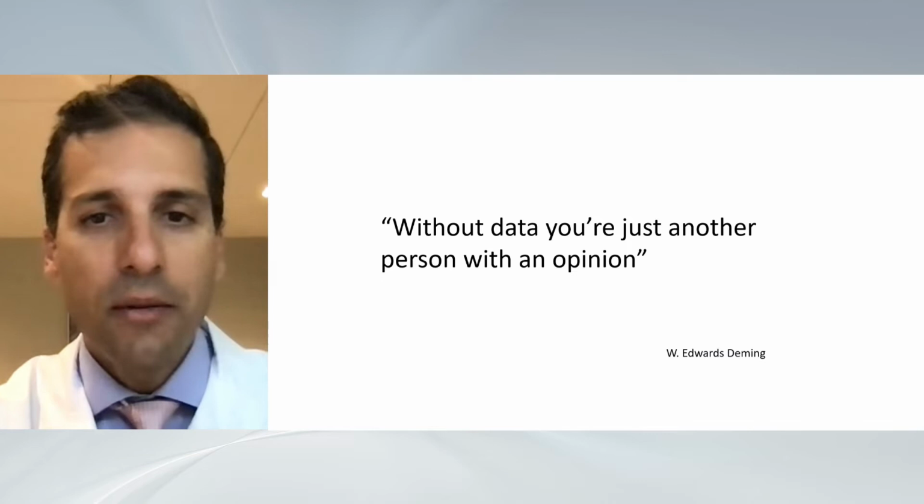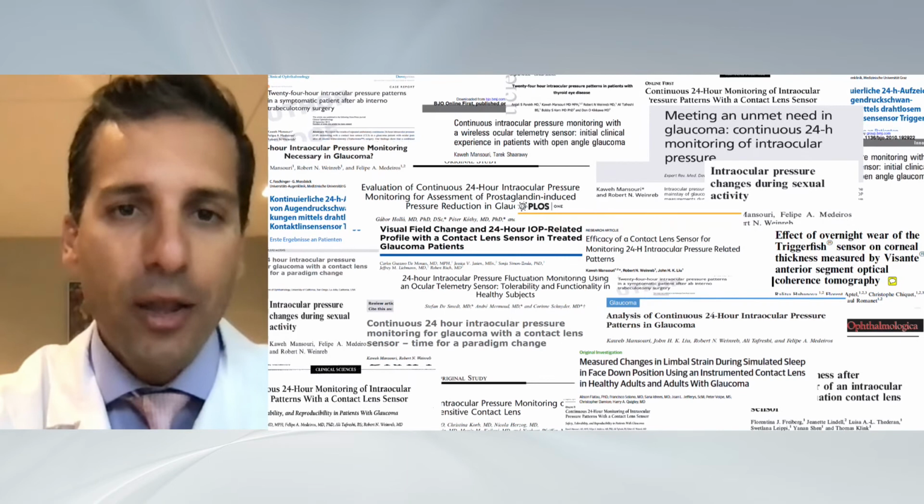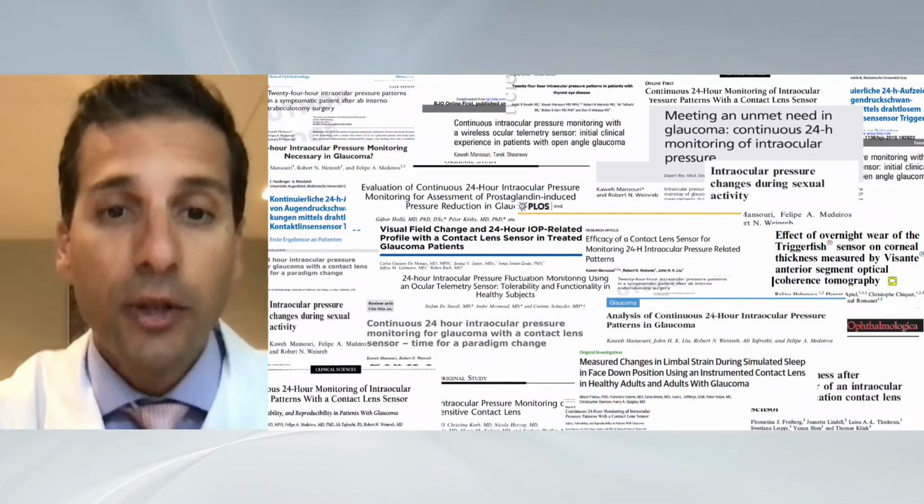Initially, there was a lot of enthusiasm. Even The Economist spoke about this device because we really believed we had an easy to use device which would measure IOP around the clock. In bench testing, in the laboratory, this was the case. The measurements were really one-to-one comparable to manometry. However, we needed to get more data, of course, and the data was forthcoming.